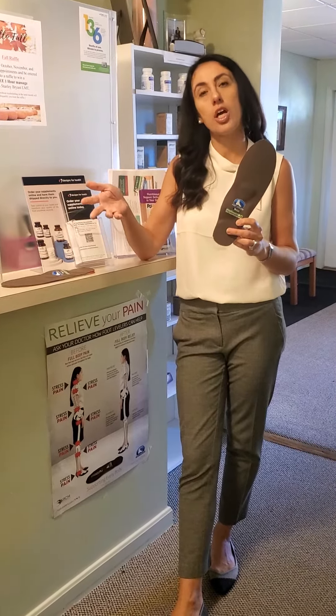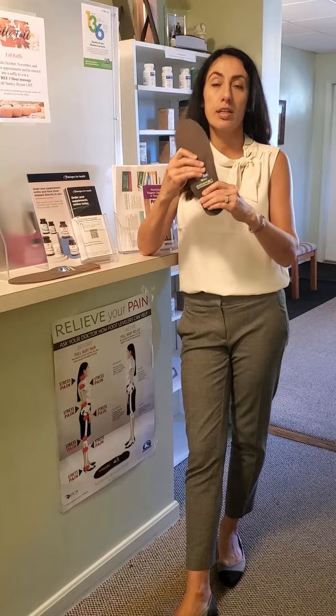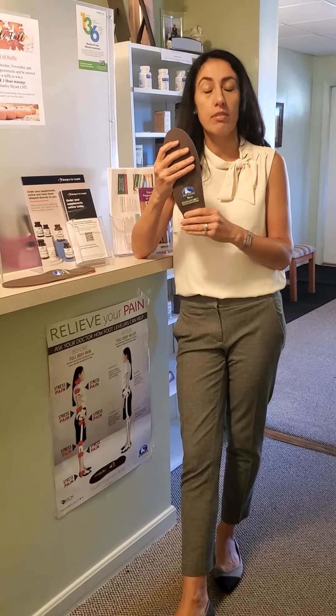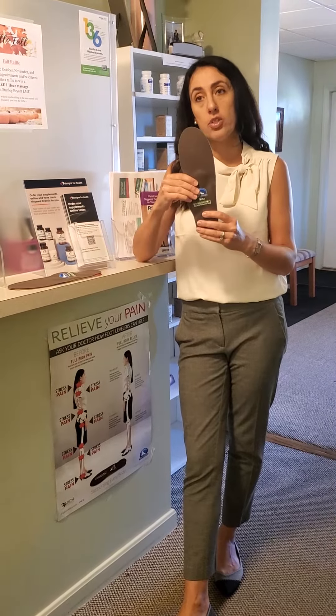Over-the-counter orthotics like Dr. Scholl's and others will not do this kind of thing. Second of all, these are considered flexible — they're not hard, not rigid, not plastic. These are actually handmade by someone at Foot Levelers. So that's the difference between the over-the-counter and Foot Levelers, and this is what makes in-motion special.